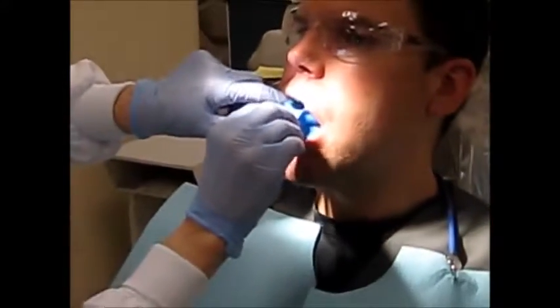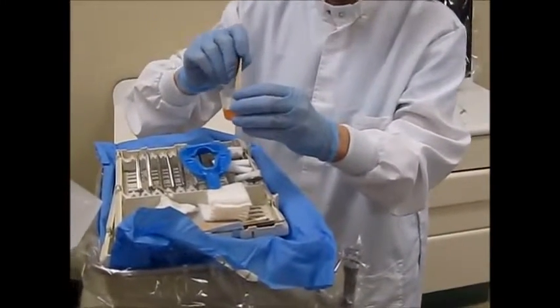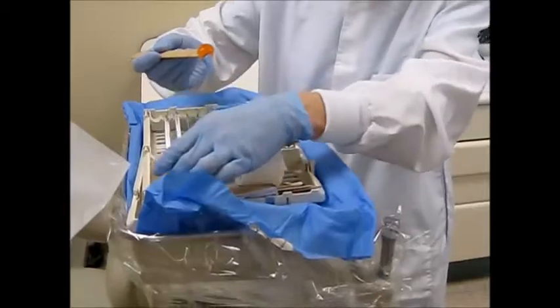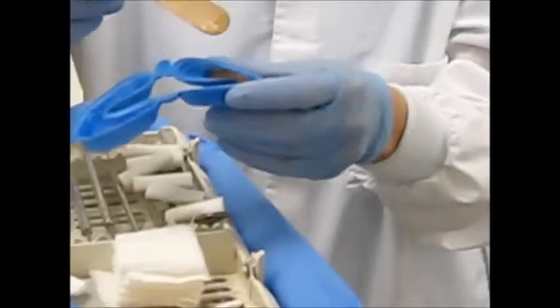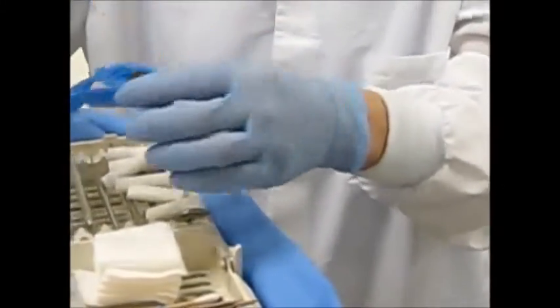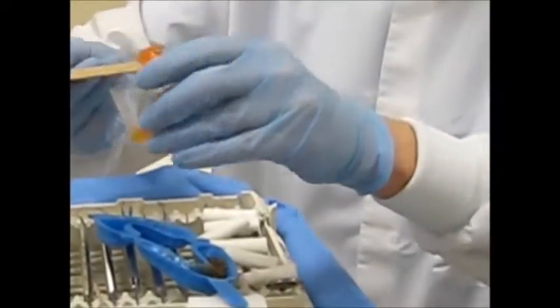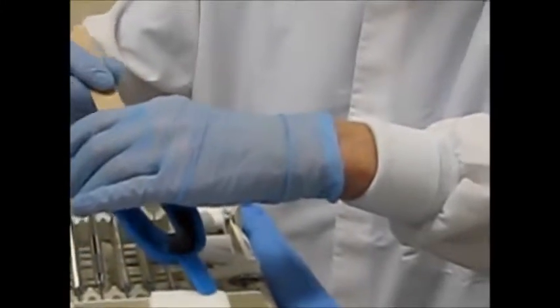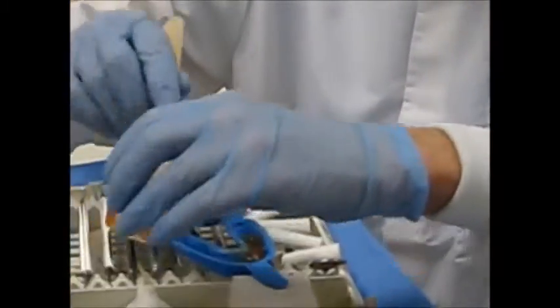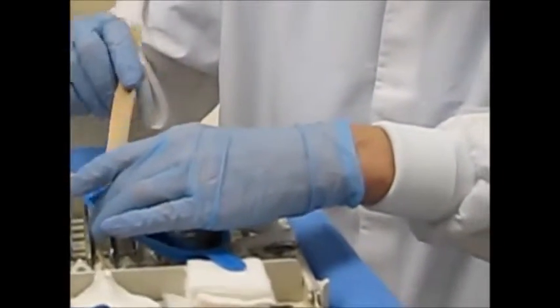I would ask the patient to open, remove the tray, and I would begin to load the fluoride in the tray. Using the tongue blade, I would dispense half the fluoride into the maxillary arch and then half the fluoride into the mandibular arch. If I had a patient that had recession and I wanted to apply some additional fluoride, I might put a milliliter more of fluoride in there and leave that in the cup so that just prior to inserting the tray, I would paint that fluoride on with a cotton swab.